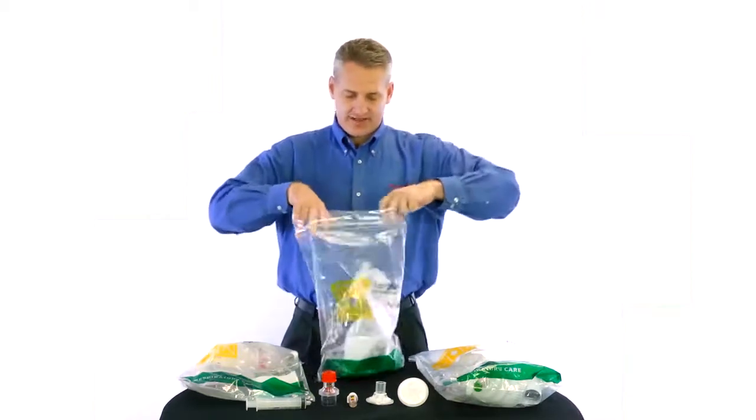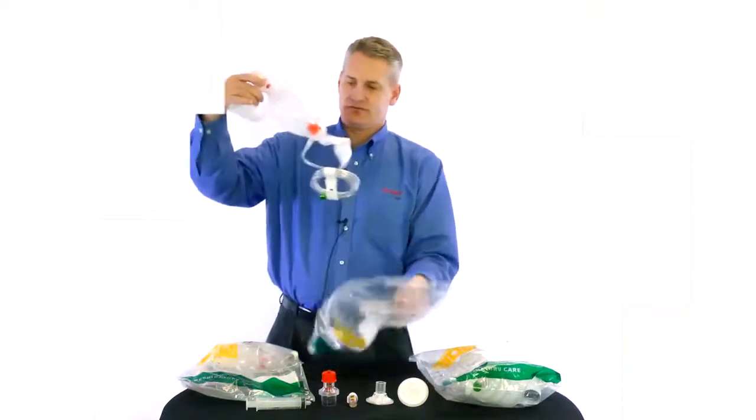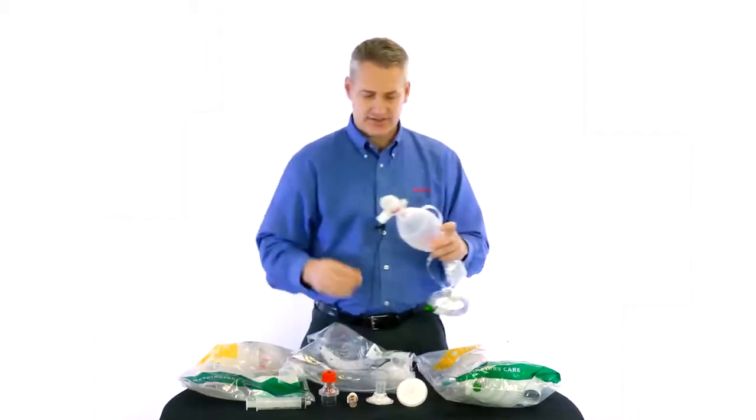When you open the bag itself, you will pull out the pediatric resuscitator, and you will notice that it has a mask attached. We are going to take this mask off for now and set it aside.